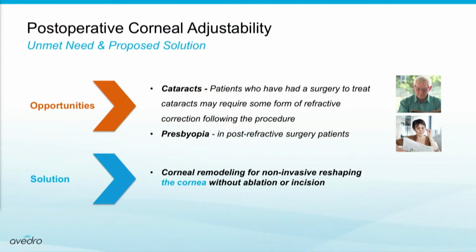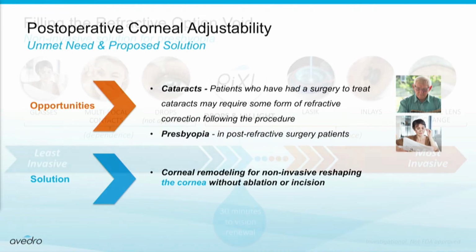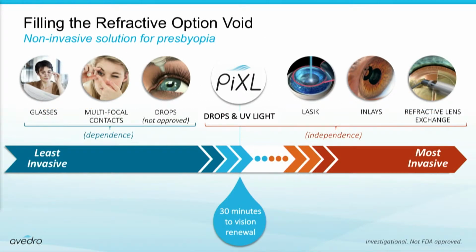So when we look at patients who have had prior surgery, what's the opportunity here? Pixel crosslinking allows us to provide a non-invasive method of treatment that doesn't require incisions and doesn't require ablation of tissue. So this can certainly be relevant or important for patients who have had prior cataract surgery and need some type of refractive adjustment. But it may also be very important for patients who are becoming presbyopic after they've had prior refractive surgery, LASIK or PRK. Or perhaps just in patients who are presbyopic in general.